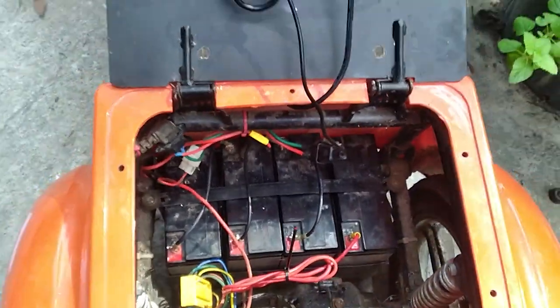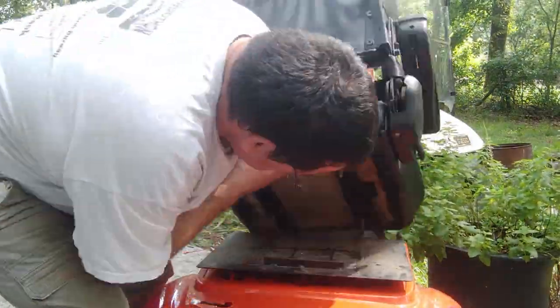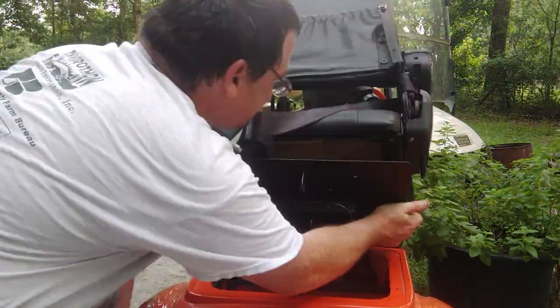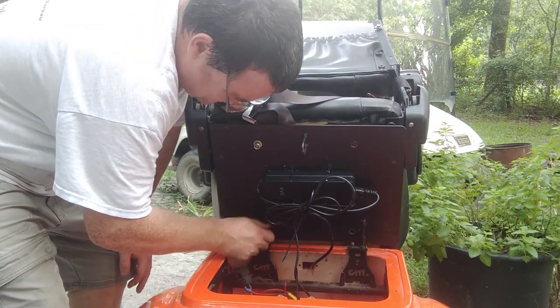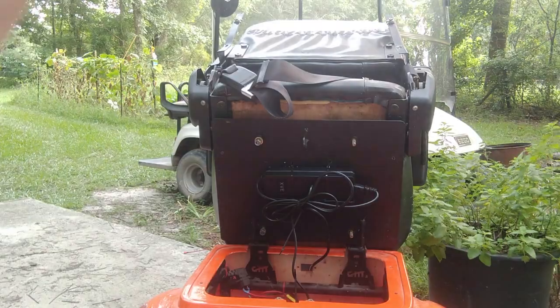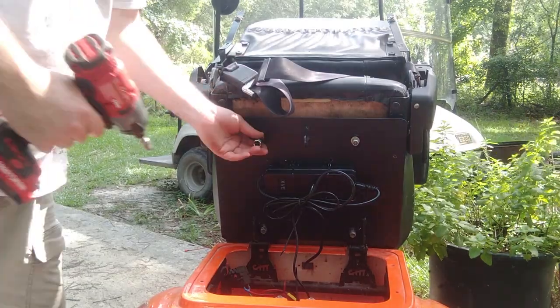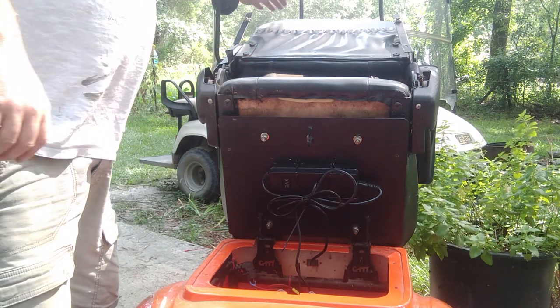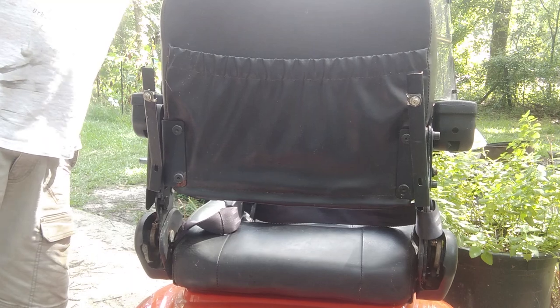Next we're going to go ahead and get that seat back on. Seat's back on — locks in place. Hell yeah.